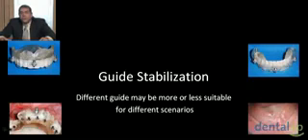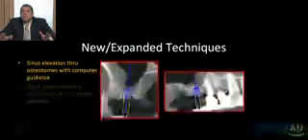And we have different guide systems. Some systems are more amenable to being soft tissue borne, some bone borne, some tooth borne. And again, it's not one tool to fix every situation. We may want to employ different types of systems for different scenarios.